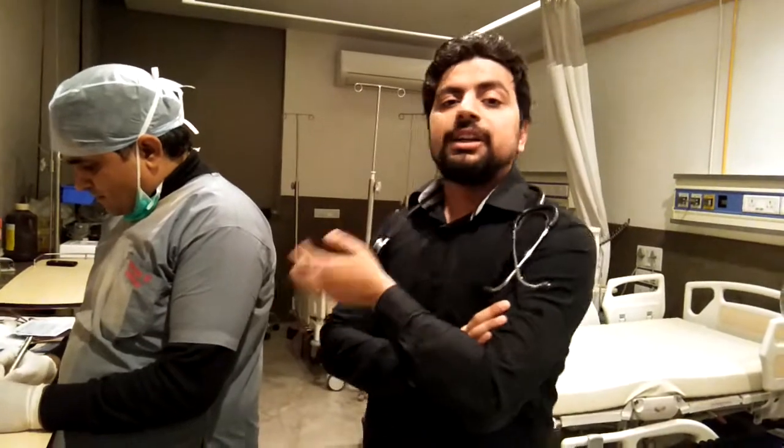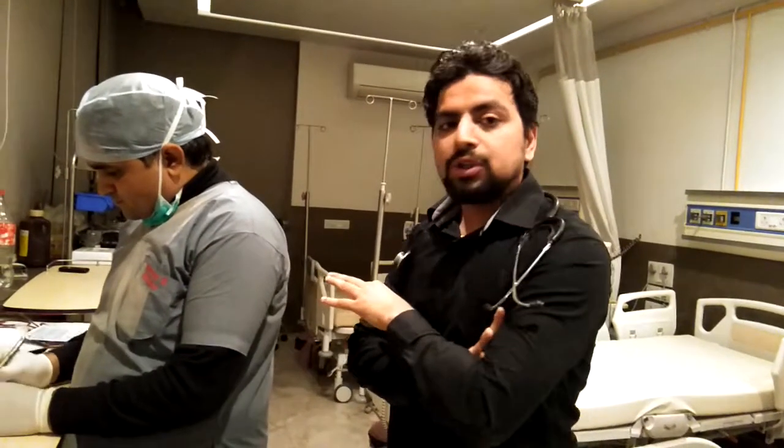This is my sign — I already signed here as Dr. Nima. Now this blood is ready to transfuse, and we are going to show how to transfuse this blood.